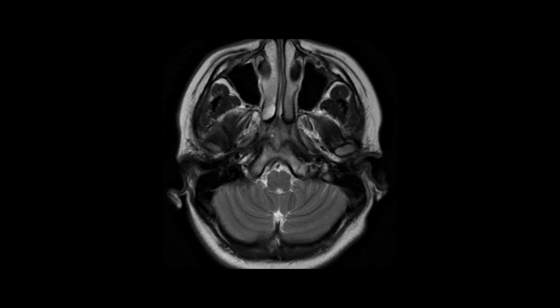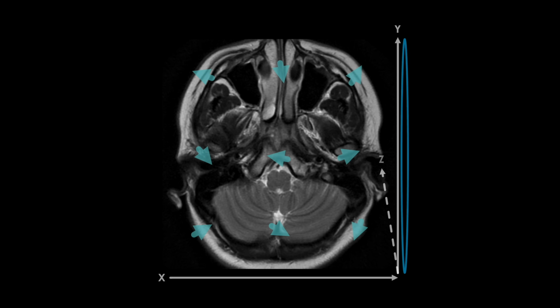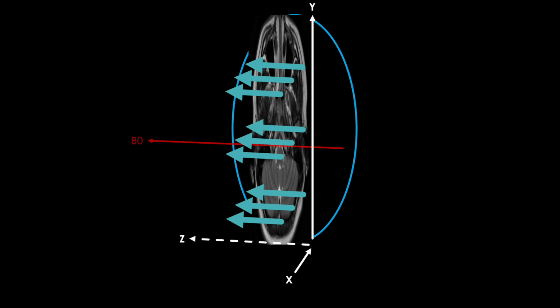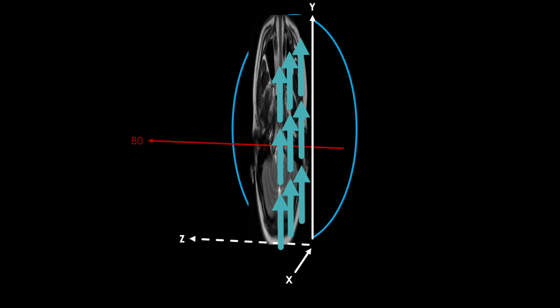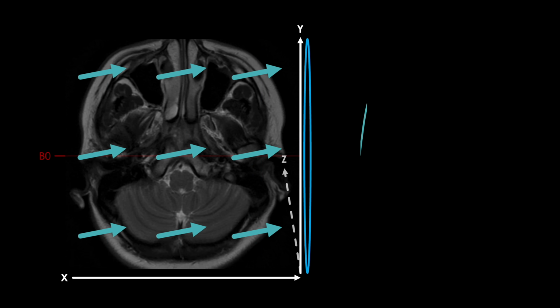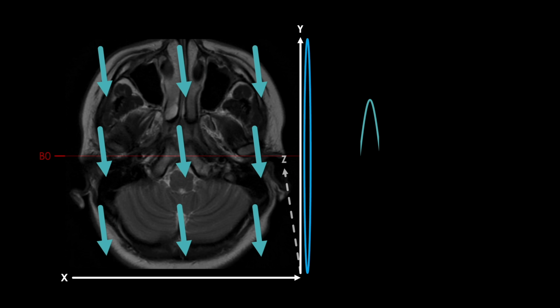As we've covered in prior lectures, we have our slice of the body we wish to image. It's filled with randomly oriented protons, and when we apply a large magnetic field, B0, we grow these magnets within each voxel of the slice, all nicely aligned with our B0 field. We then apply an RF pulse to energize the system, and then they begin precessing in concert with one another, generating signal within our receiver coil.